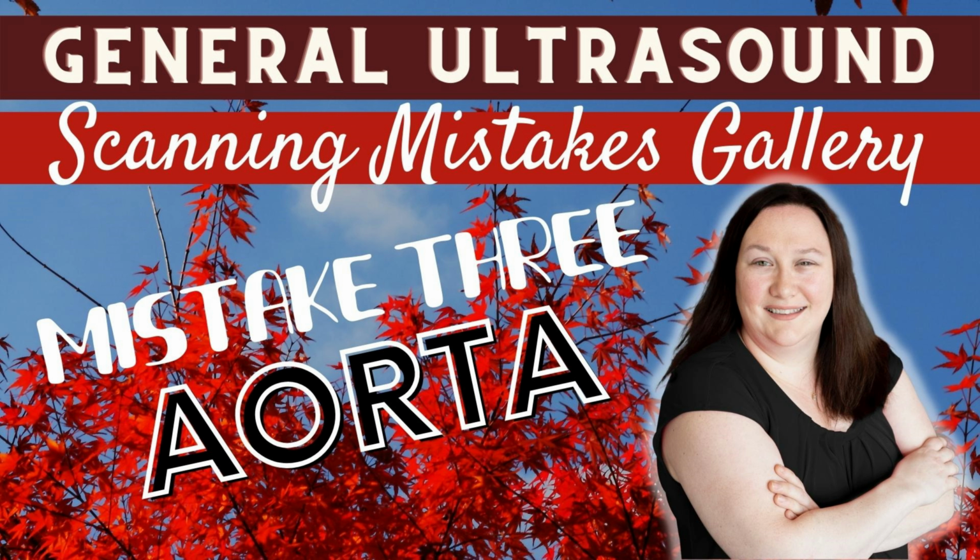Let's ultrasound. On today's edition of General Ultrasound, we're diving into the Scanning Mistakes Gallery. On today's episode, Aorta Mistake number 3.